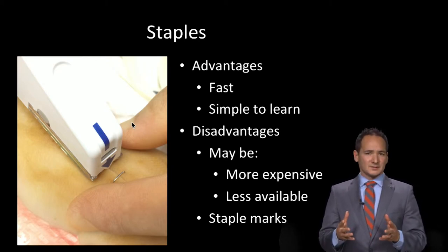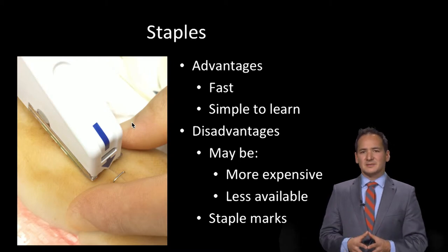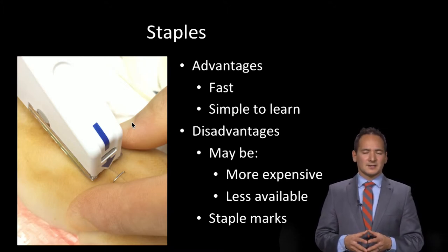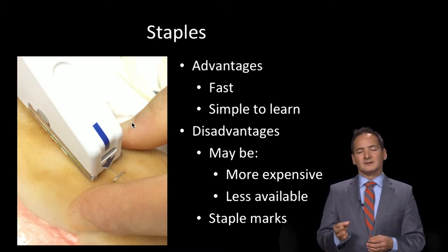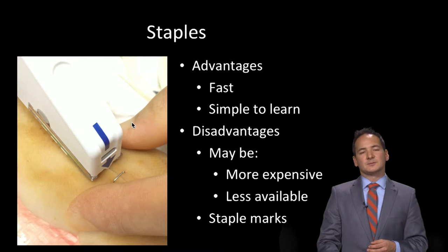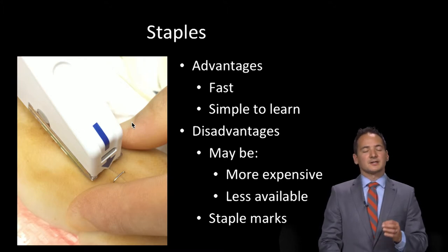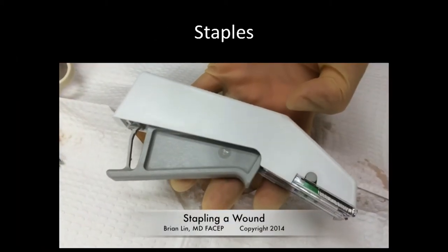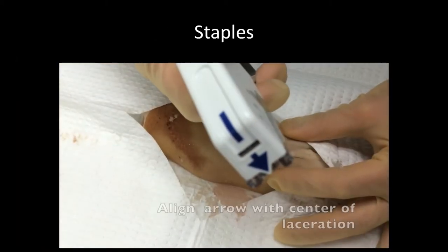Now, the disadvantage of using staples is in some situations or some locations, they may be more expensive and less available to some providers. Also, staples carry that same risk that sutures do of leaving staple marks like train tracks on either side of the wound if they're left in for too long. And this is especially more prominent if used on non-hairy areas of the skin or in patients with particularly light skin. Let's review the technique of placing staples within a wound.